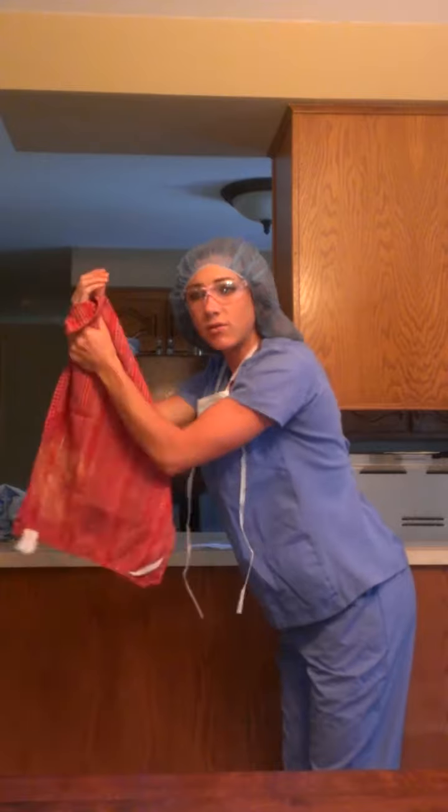The reason I'm bent over, I don't want water getting all over my surgical attire, my scrubs. If I get water all over, it's called strike-through contamination. We would have to start over, change, start over, do the whole thing again. So I'm bent over, patting dry. Throw the towel off to the side, circulator will come by and grab it.